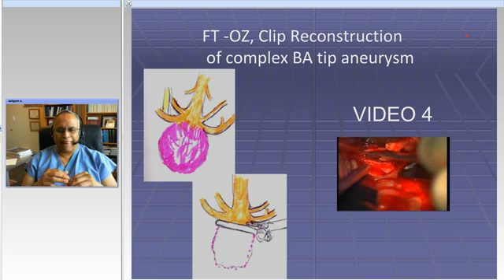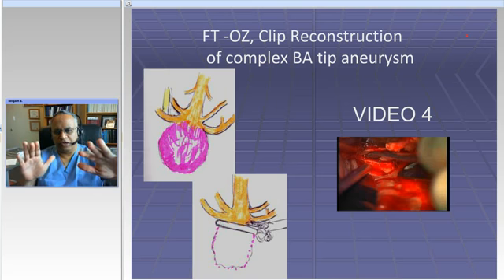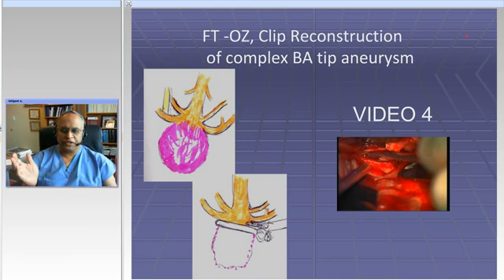The next step is that frequently, not in this case, we will remove the posterior clinoid. And how do we do that? We open the cavernous sinus and inject fibrin glue inside, and then we'll use the ultrasonic bone curette. The one that is available right now is the Sonopet, but there are other ones coming on in the market later on. And we'll remove the posterior clinoid process. So when we're doing that, we'll protect the aneurysm with a small cotton patty. Then we'll place the patient in burst suppression and apply a temporary clip.